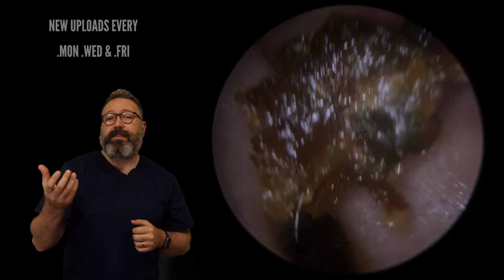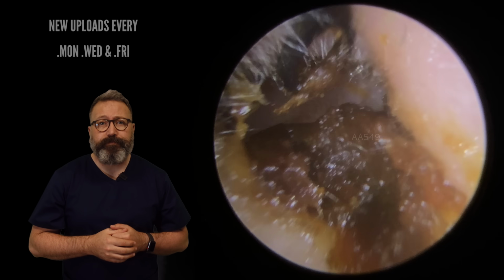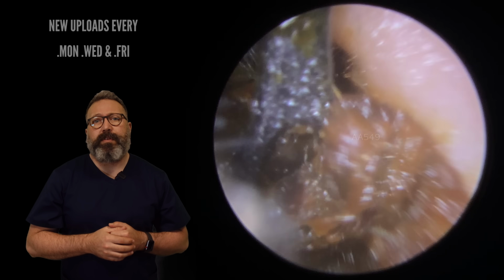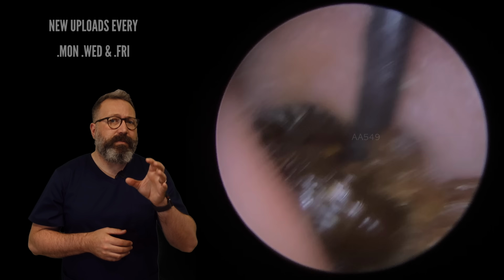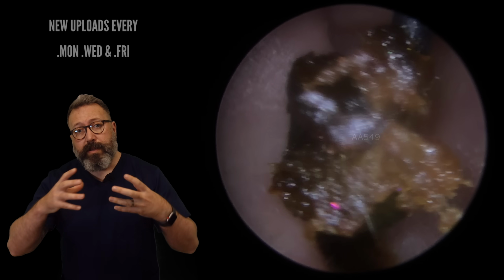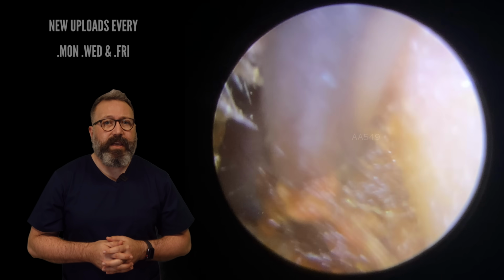Now don't forget, this was the patient's worst of the 2 ears. This is one they felt more blocked up in. Which is kind of understandable because you've got quite a big old plug on that. But the other side, I would say, was probably causing more trouble by sitting down against the eardrum. Whereas I think this plug was sitting more on the, there was more of the wax, don't get me wrong, but it was sitting more on the outer part of the ear canal. So not causing as many issues really on this side.